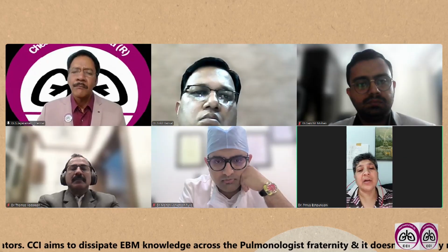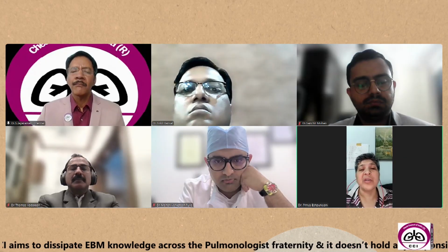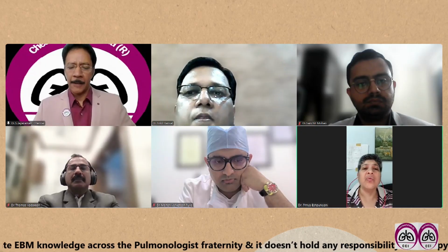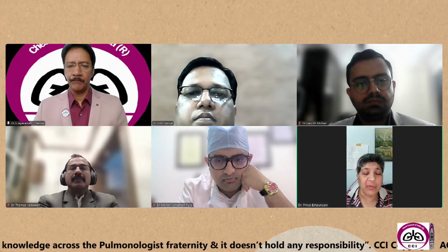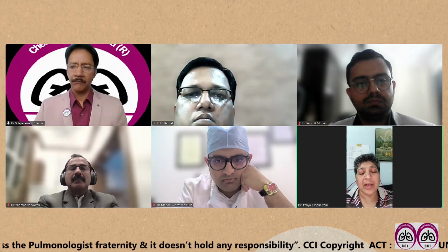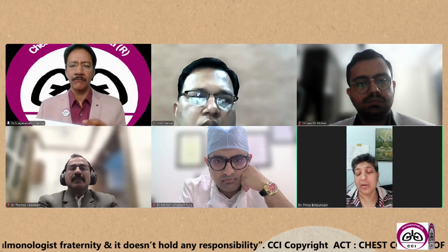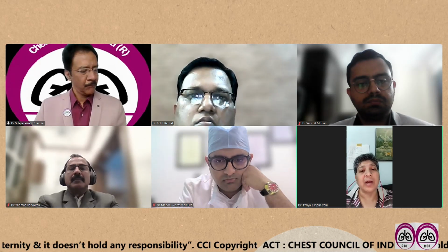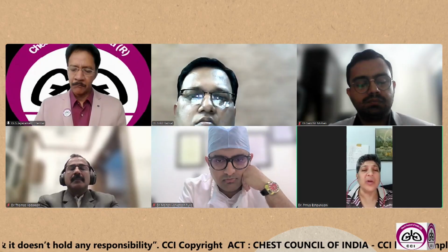That is a field which has undergone fibrosis. That is a field which has undergone a lot of inflammation with chemotherapy, immunotherapy. So to do mediastinoscopy in that field is also very difficult. Articles and literature have quoted a yield of 77 to almost 90% with EBUS plus EUS.